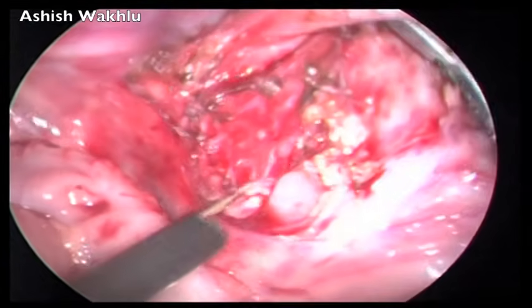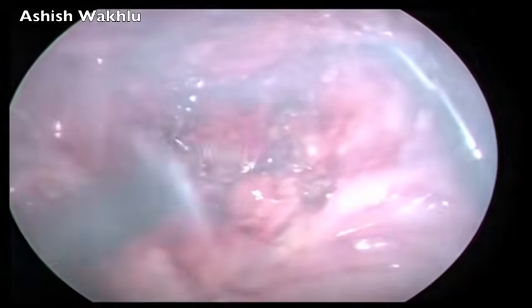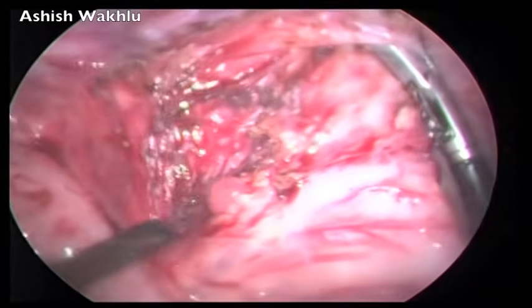So, attempting to find the gap in the mesentery below the inferior limit of the rectal wall, the dissection continues to reduce the thickness of the rectal mesentery. Occasionally, you encounter a lymph node, as seen here.